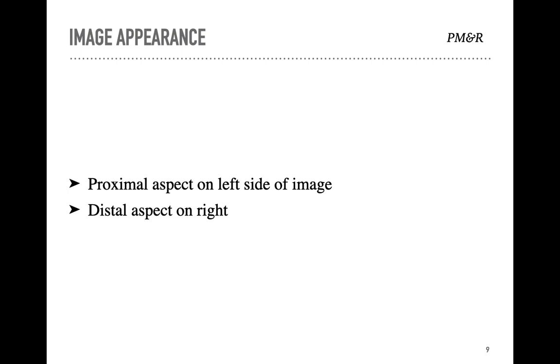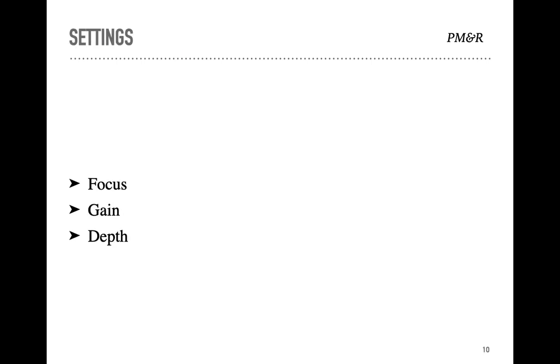As an international dictum, the proximal aspect is usually kept on the left side of the image. So it's all about common sense, how you are comfortable. Usually the proximal aspect is on the left side of the image and the distal aspect on the right. But some physicians have their own ways of keeping the probe, so make sure that you're not getting confused.